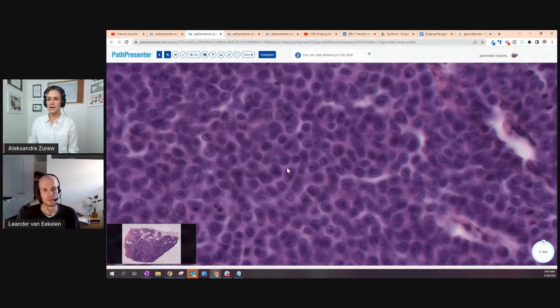Okay, because usually when you want to do something with the nuclei, you want to count them, you want to have an object. So you're telling me semantic segmentation is not for objects. Don't use it for objects, because if you do, you're going to have something like that. Yeah. There's a small caveat, of course, and I think here it's also good to move to the next concept, which is instance segmentation, which contrasts very nicely with semantic segmentation.